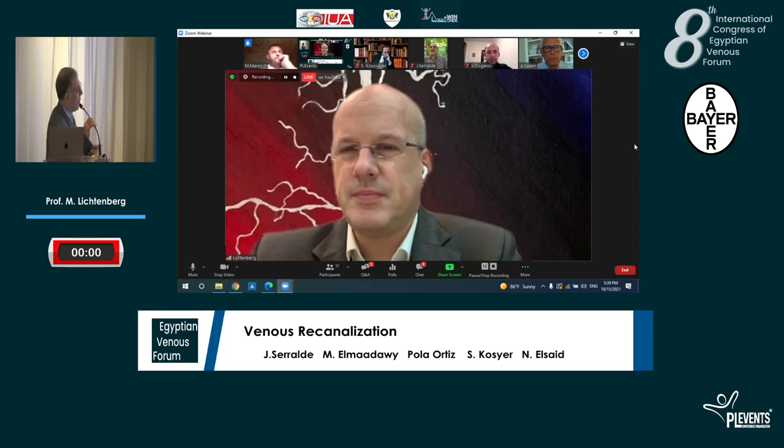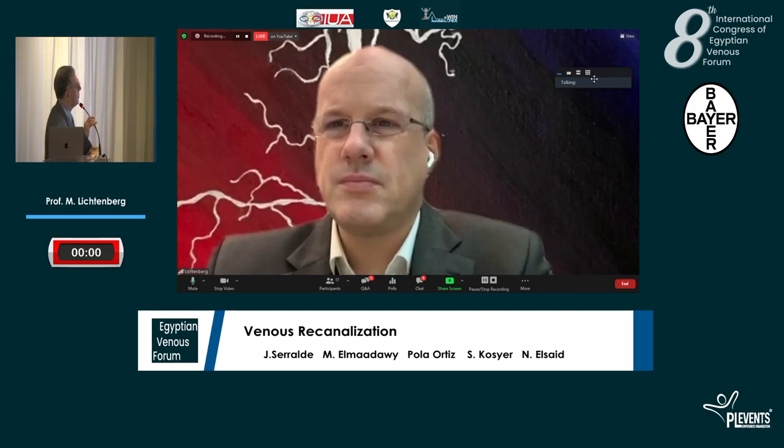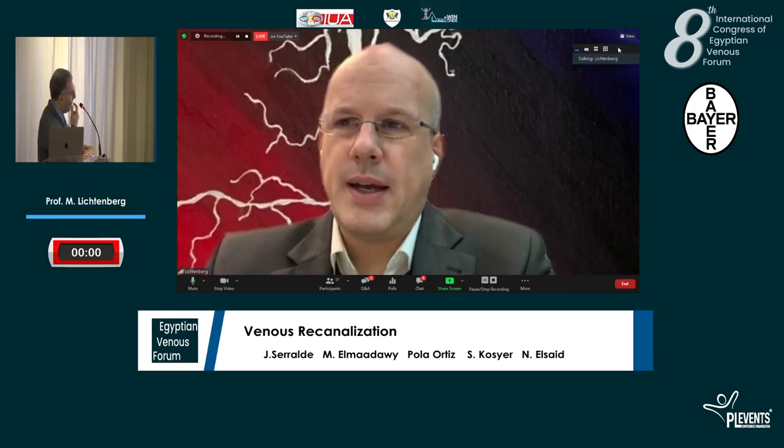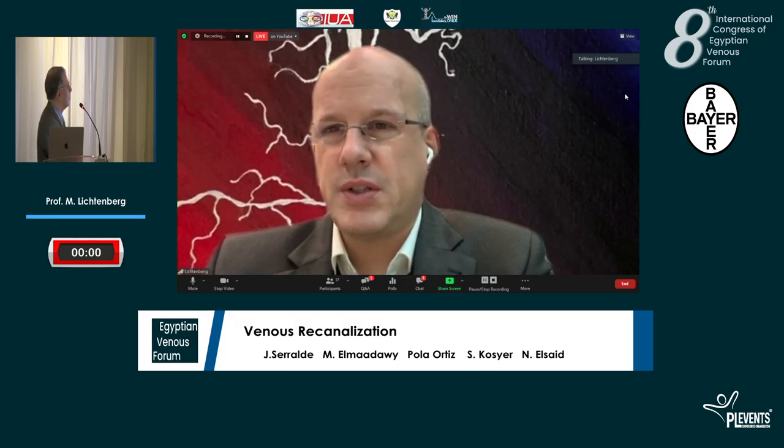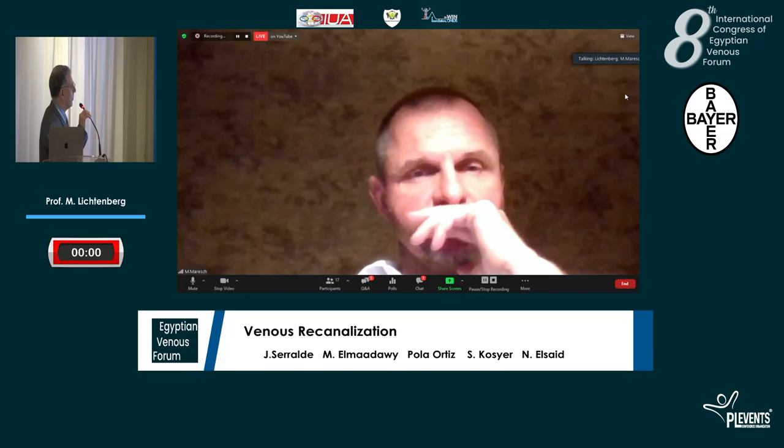Right. Does this lead me to ask one further question? How much do you depend on the IVUS in your deployment of the stent? Yeah, these days I definitely do 100% of the cases with intravascular ultrasound to learn more about the correct reference vessel diameter, to learn from where to where we should stand, to learn more about the landing zones. And actually 2 weeks ago, during the VIVA Congress, a consensus paper was shown by some colleagues, and they definitely advocate for IVUS guided venous intervention. So IVUS is a significant important factor.